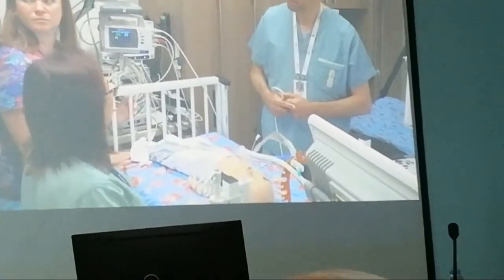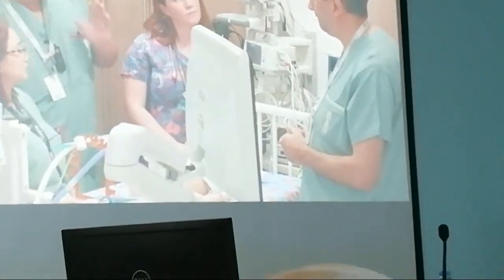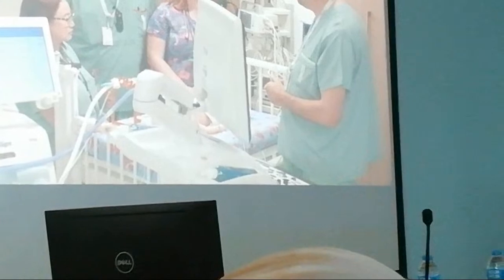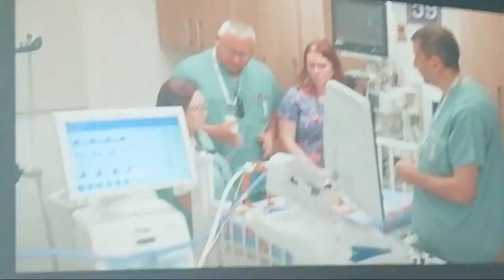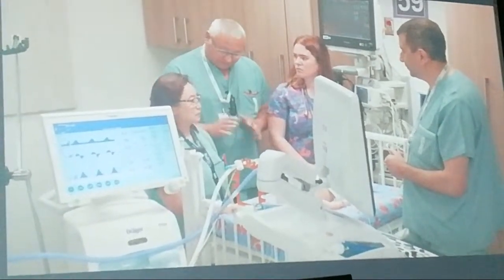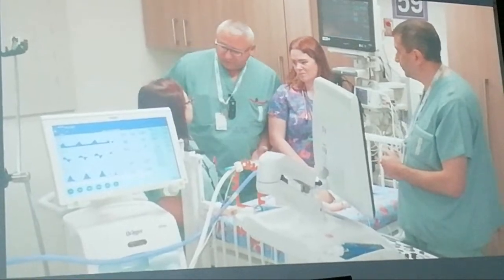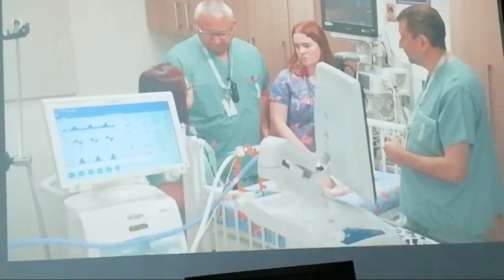So, Dr. Bellin, what I think we can do, we have no pulmonary hypertension, and we have all the monitors, we have SATs, we have blood pressure. So I'll recommend that we do a best PEEP study. What we'll do is I'll turn the PEEP up by 1, and leave it there for about 10 minutes, and then see if the FiO2 stays the same or goes down. And then I'll keep doing that to, let's say, a maximum peak of around, how much would you feel comfortable with me going on the test? So how much are we targeting?